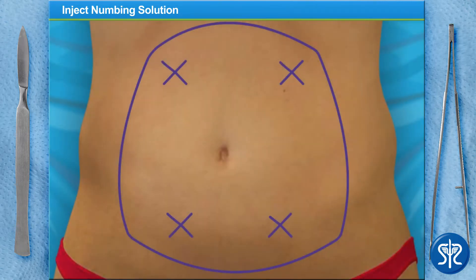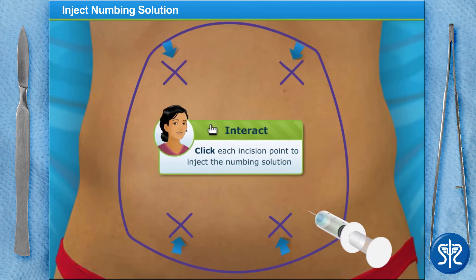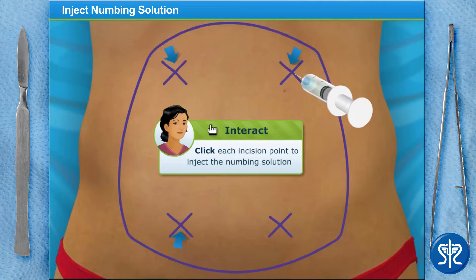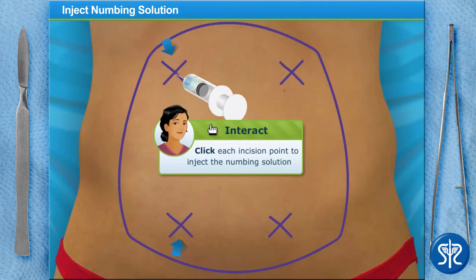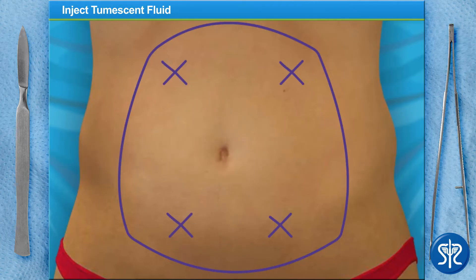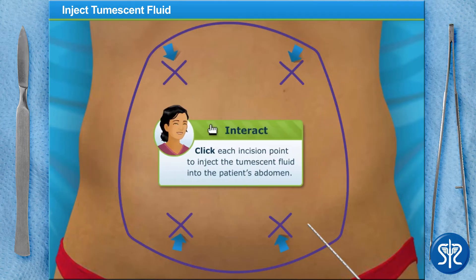Our patient has been prepped and is now in the operating room. The next step is to numb the incision points that we're going to use to extract the fat deposits. Give it a try! With the incision points numbed, we're going to inject the tumescent fluid using an infiltration cannula to anesthetize the target areas and dislodge the fat deposits, making it easier to suction them out. Go ahead and take a stab at it!